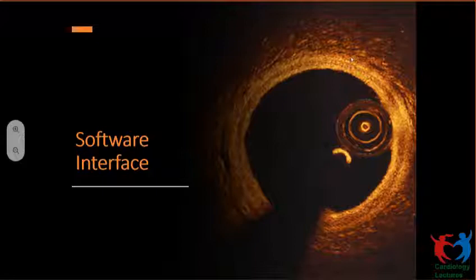Everything will disappear. And whether it is secondary to a plaque erosion or a plaque rupture, OCT at the end of 4 weeks will completely show you where the plaque was located, which has ruptured, and how ugly it looks now. But I will tell you, for each ruptured plaque, there are millions of unruptured plaques. And for each large ruptured plaque, there are millions of small ruptured plaques. So there is a process of continuous healing which takes place in the vessel. So if the MLA is large enough, you should not be scared of leaving this plaque alone. It is going to heal over a period of time.